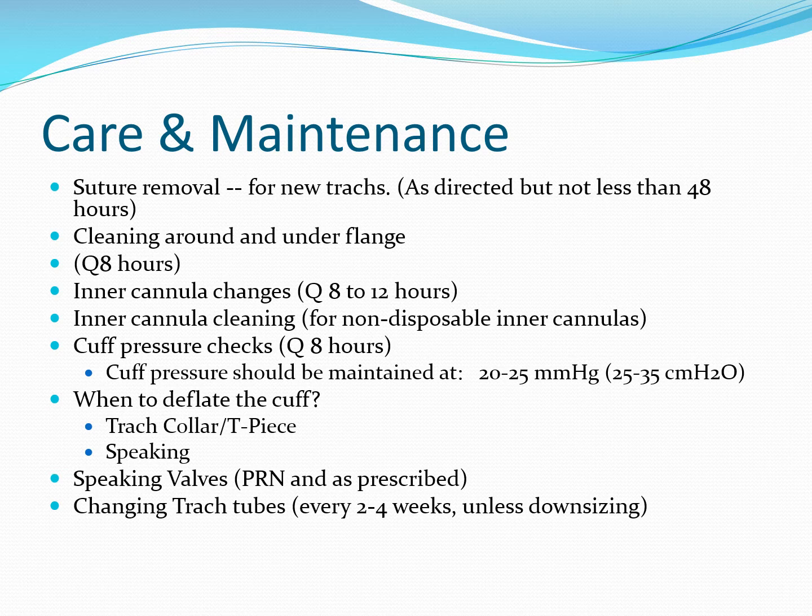For the first day or so after the surgery, they may elect to keep the cuff inflated to help reduce the amount of drainage that goes down into the airway and potentially into the lungs. But by and large, for spontaneous breathers who have cuffed trach tubes, the cuff should be deflated.